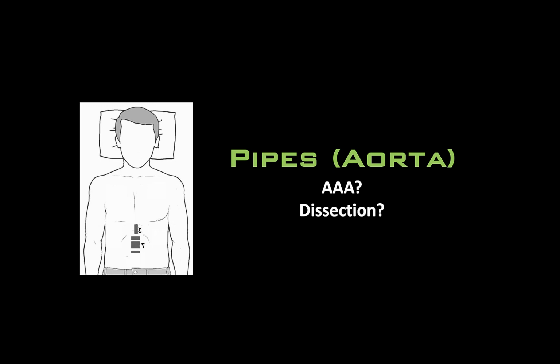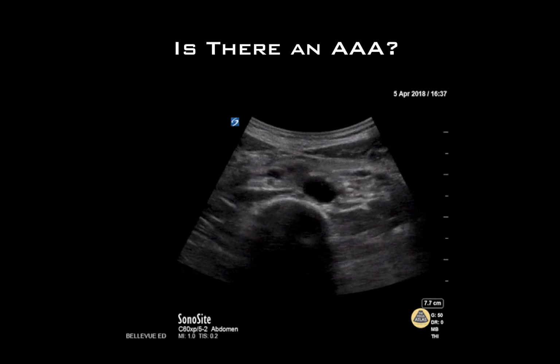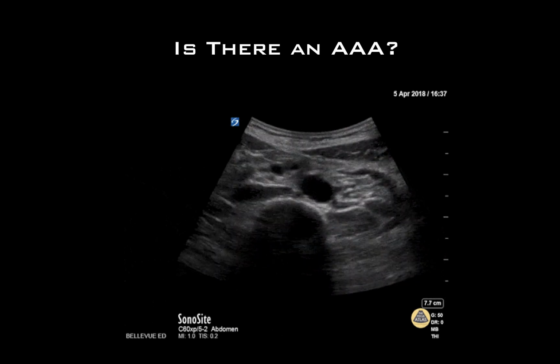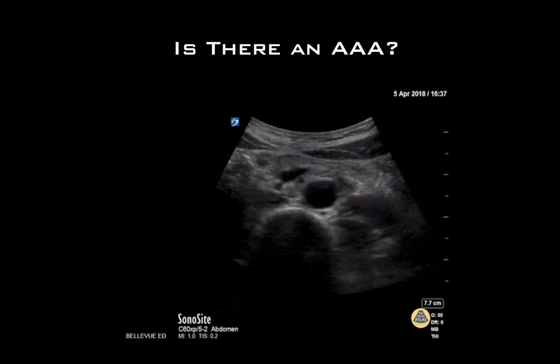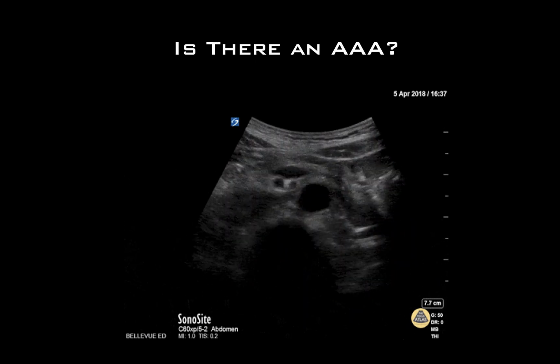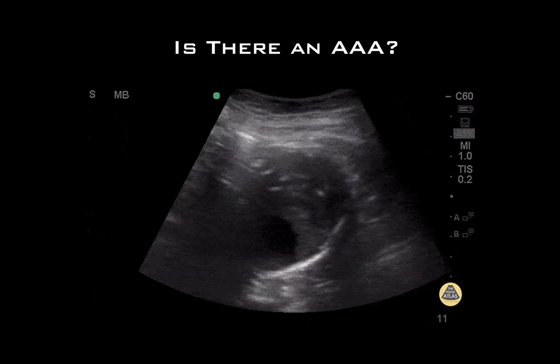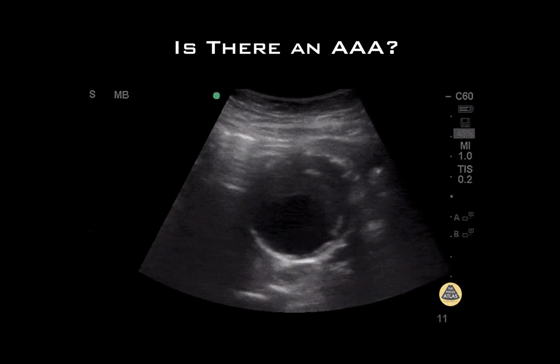dissection. The aorta is scanned transabdominally in the transverse orientation from the xiphoid process down into the bifurcation into the iliacs. Any enlargement beyond 3 centimeters is abnormal, and anything beyond 5 is concerning for imminent if not already ruptured. Here is an example of a normal appearing aorta viewed distally to the bifurcation, while here is an example of an aneurysmal aorta measuring 5.6 centimeters leading edge to leading edge. Clearly visible is a large mural thrombus with decreasing diameter of the true lumen.